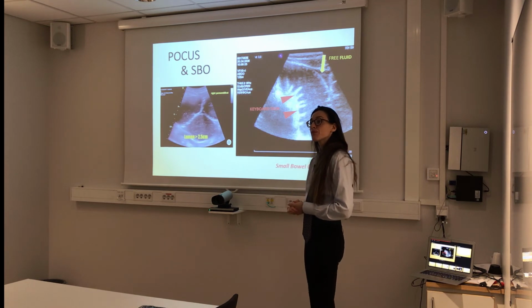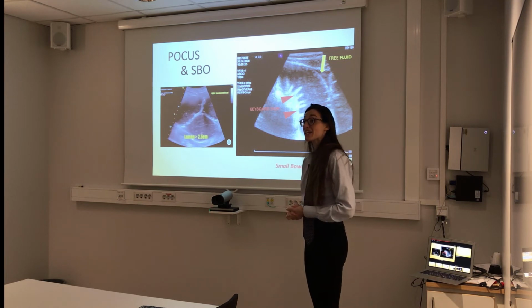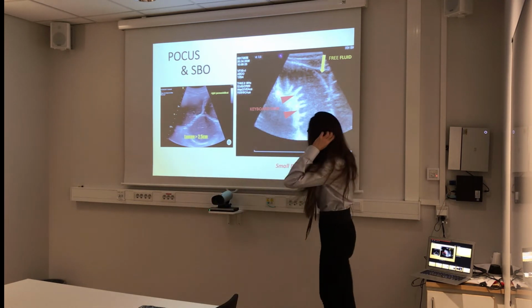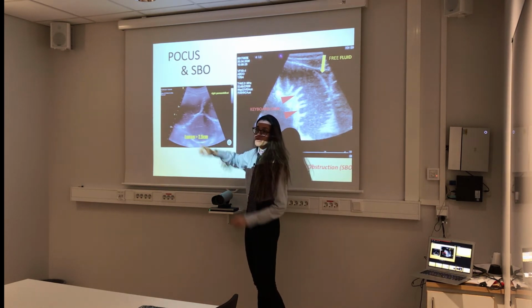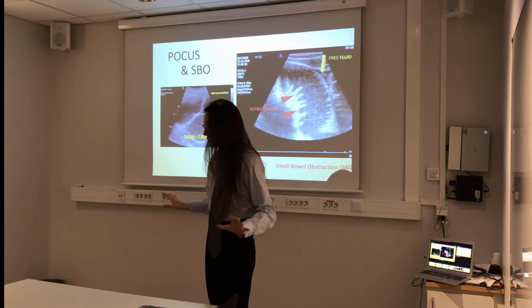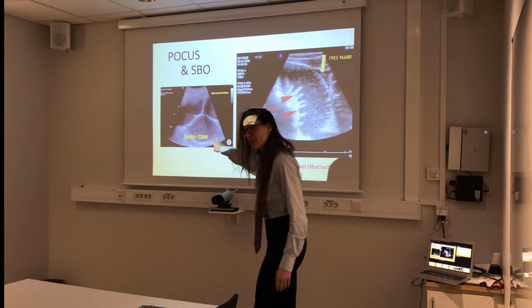There it looks super clear. Yeah. I'm wondering, why is there no gas? Because if you look at a CT picture, you see these gas levels, right? Because probably, if you moved, you see, here there is a little bit of gas. If you moved around, this is just a gif to make sure that you see that the lumen is more than 2.5, which is one of the most specific. So if you got a lumen more than 2.5, guys, this is an SBO, no matter what. This is an SBO by definition, okay? This is one of the more specific, up to 100% in the last study that I will show you.